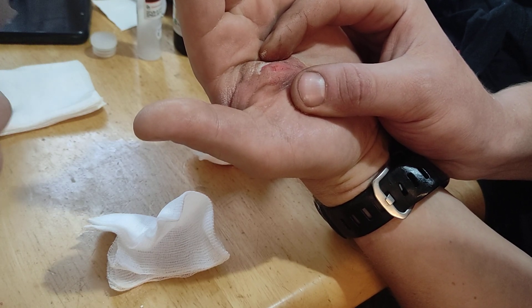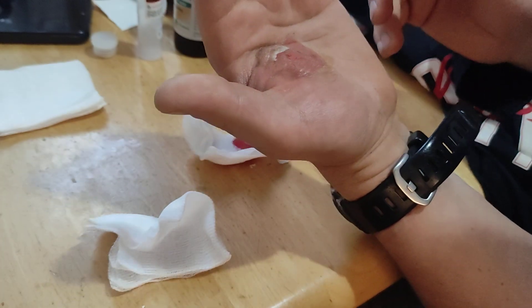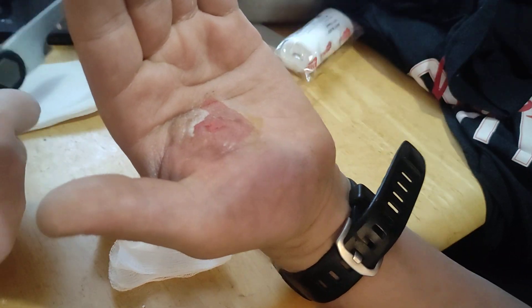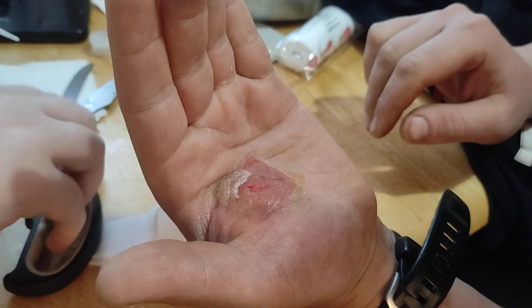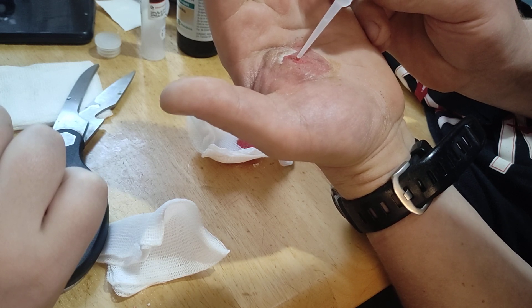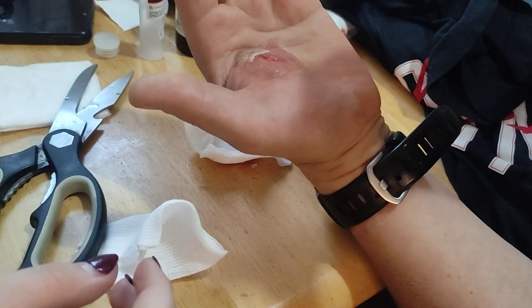Should you keep it and I'll glue myself? No, I trust myself more — I don't trust you. Chop it. I'll do it. Don't point it against me. Can you see it? It's somewhere around here. This is our canal — can you see where it is? From here to here. One straight line. Now we wait 60 seconds. I'll stop the video so you don't have to wait.